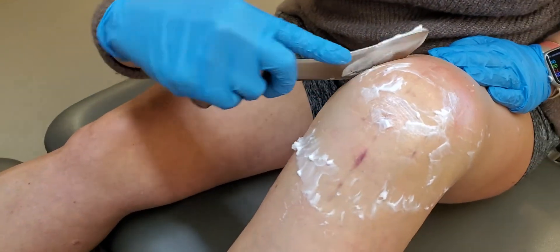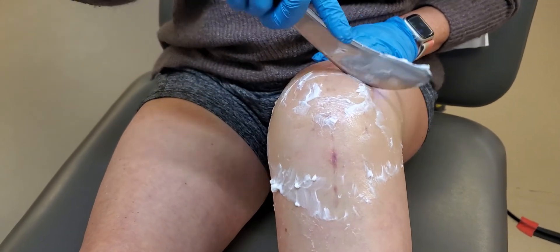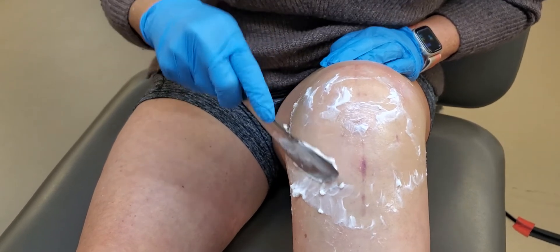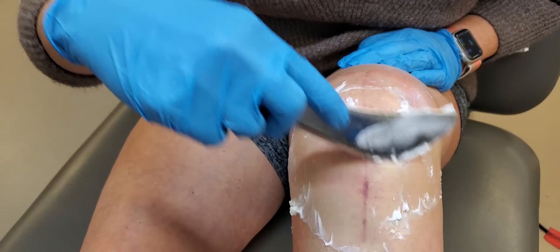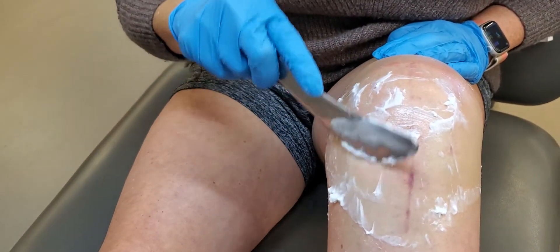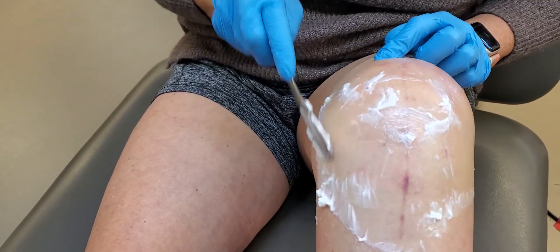You're not going to notice an acute significant change from one day to the next, but you're just going to put your pennies in the bank with the trust that you'll get your return on investment — allowing the scar tissue to have greater pliability and allowing the patella to move more readily as compared to the other side.